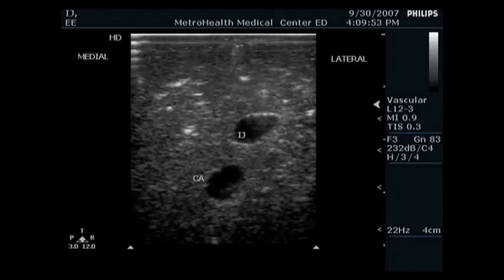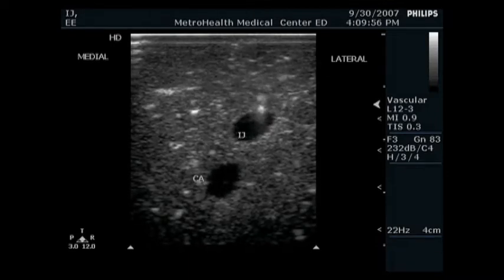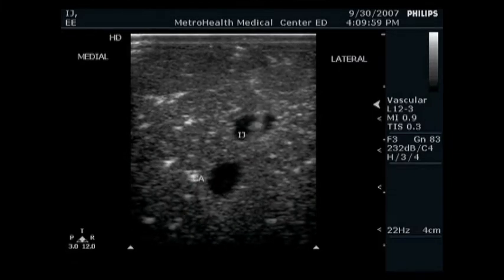Once the needle tip is under the skin, you'll continue to follow it as it approaches the anterior wall of the vessel, using small jabs of the needle in order to avoid dragging subcutaneous tissue towards the vessel. As the needle approaches the vessel, the anterior vessel wall will deform or tent slightly. Proceed with a short jab to puncture the vessel wall.